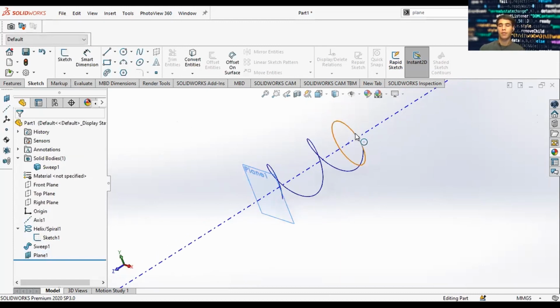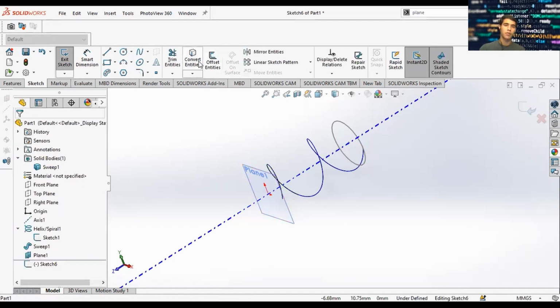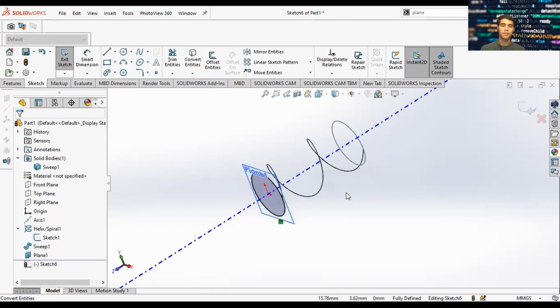And now we're going to draw the exact same circle on the plane. So there's two ways to go about this. You can go here to sketch and you can sketch a circle. Or if you want this exact same shape, since you might be doing more complex geometry, I'll show you a feature that can give you that step. So we click sketch, we select our plane, and we do convert entities. So convert entities is going to get this circle and convert it onto this plane. It's going to project onto the plane that we just had.